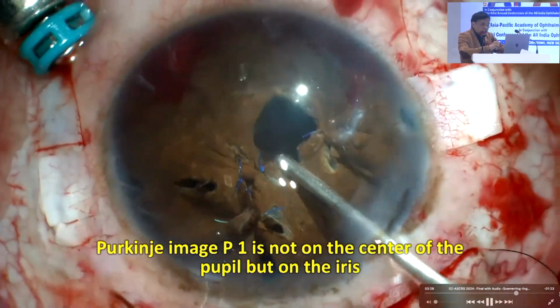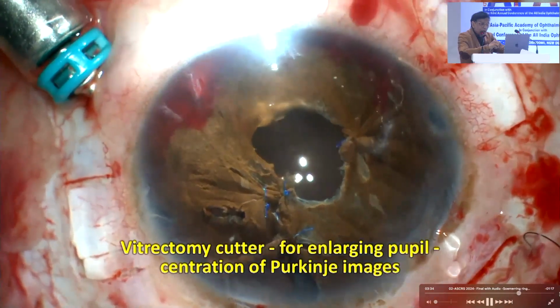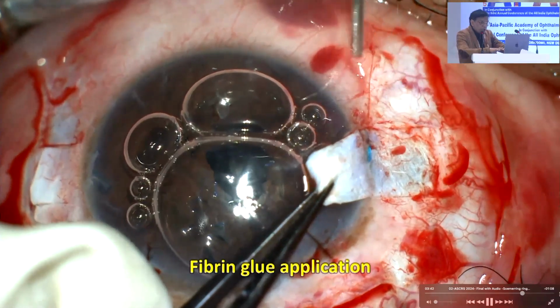Anyway, coming back to this case, I thought use a vitrectomy probe. See the Purkinje image. That should be bang centered. And look at that Purkinje image. Don't look at the inverted Purkinje image. That is P4. Don't focus on that. Focus on the P1.